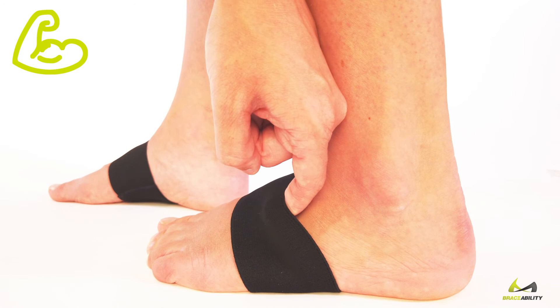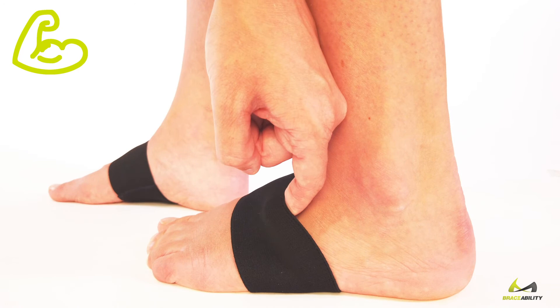They're durable and easy to wash. How to apply: slide the band over your toes like a sock. The band should sit around the arch of your foot with stitching on the bottom.